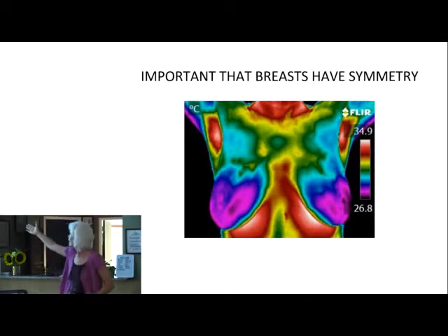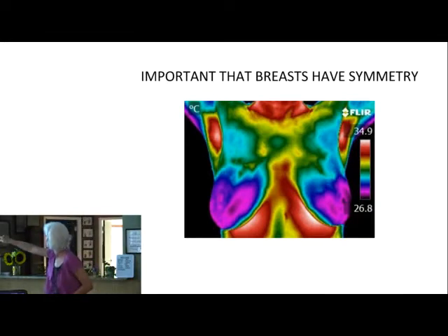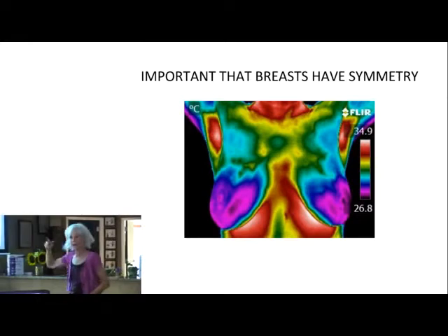This is an image of a healthy breast because of the symmetry and no areas that we can see in this image that need to be investigated as far as is there any heat difference between one area of the breast versus another. There are not in this particular image. How about the next one, Effie?